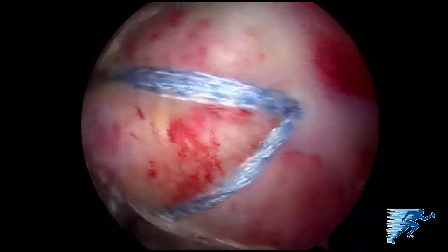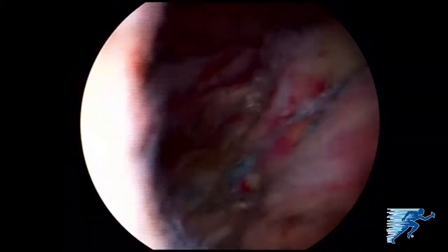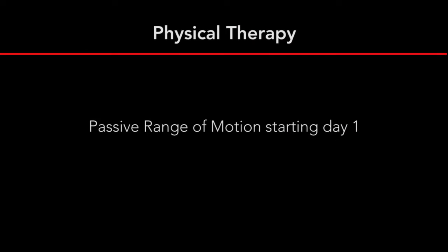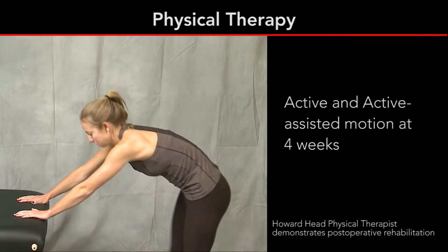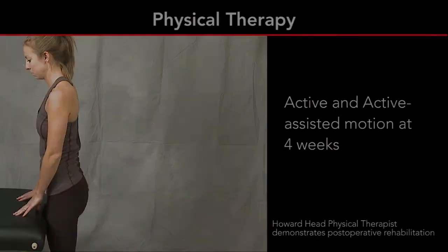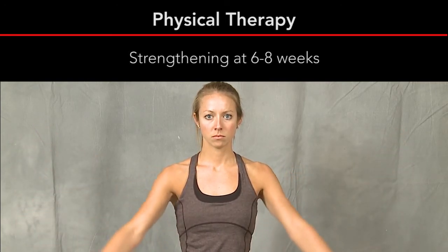The complete repair with eight anchors is visualized, demonstrating a low-profile complete closure of the rotator cuff around the humeral head. Physical therapy is started with early passive range of motion. We can typically progress to active and active-assisted motion at four weeks, with active forward elevation starting at about four weeks and strengthening starting at about six to eight weeks for a large tear with good quality tissue.